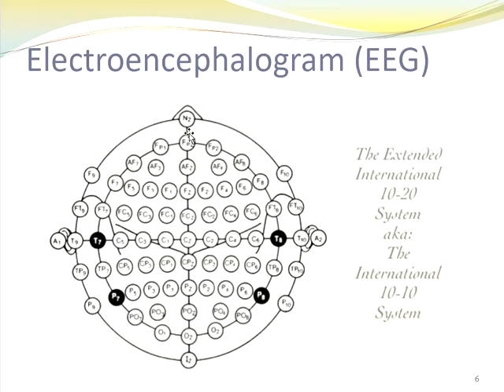The first identifying letter is the area of the brain that it's over. Frontal lobe, anterior frontal, frontal polar, central, parietal, and then if you notice, left side's all the odd numbers, right side's all the even numbers, and as you get further away from the midline, the numbers go up, so the higher the number, the further away from midline it is. This is an extended version of the 21 lead system.